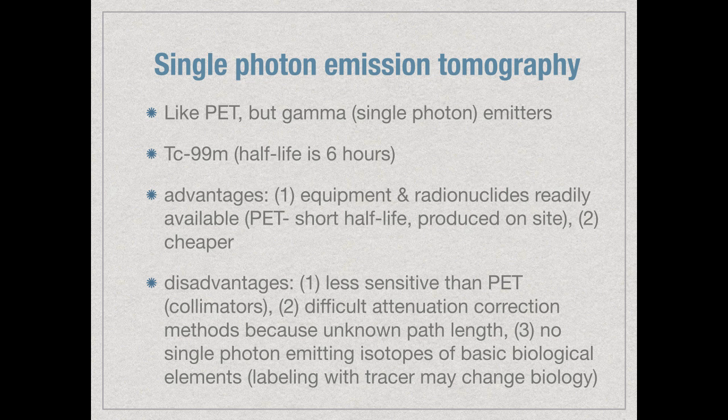Tech-99 is one of the radioisotopes. Its half-life is about 6 hours. The other isotope is indium-111. This has about a 4-hour half-life. No, 2.8 day half-life. So that is a really good isotope for nanoparticles.